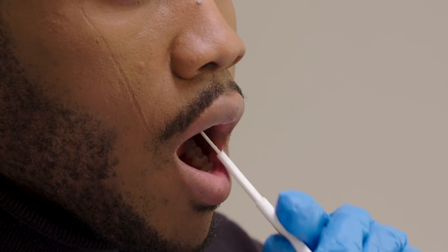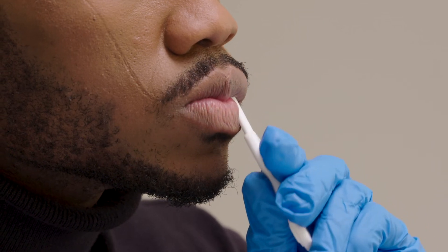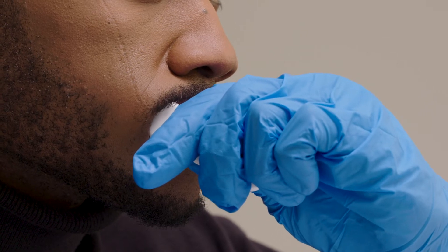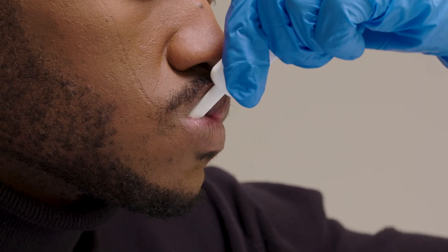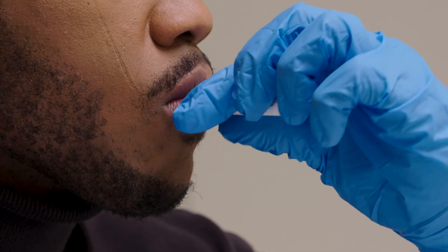Direct the client to place the flat pad above the teeth against the outer gum, and then have them gently swab around the outer gums, both upper and lower, one time around. Using the flat pad, they should avoid touching the flat pad to the inside of their cheeks, tongue, or the roof of their mouth.